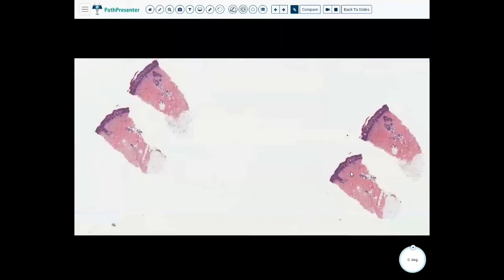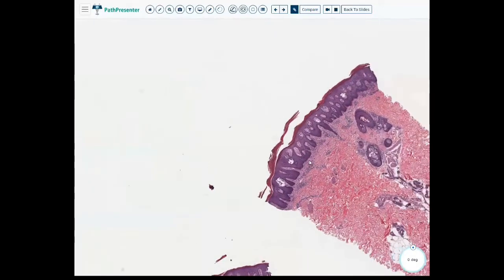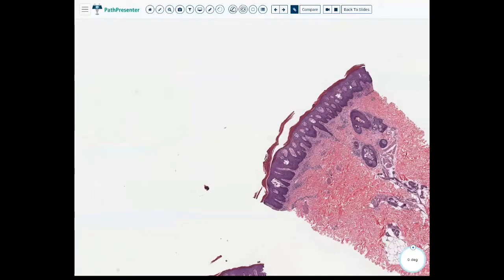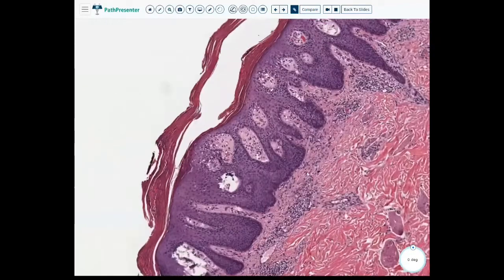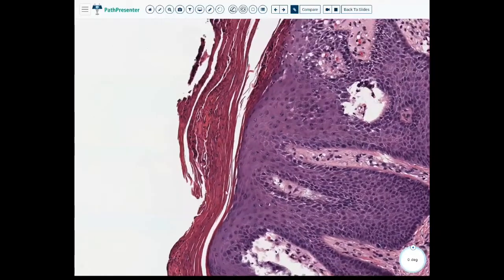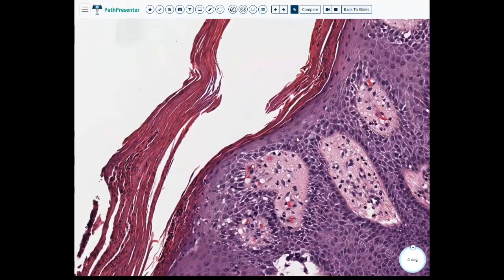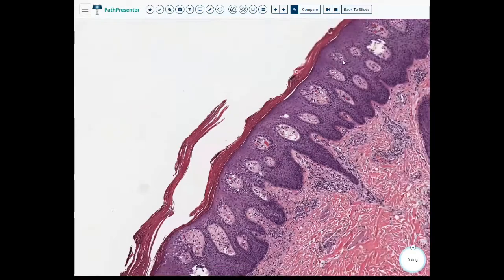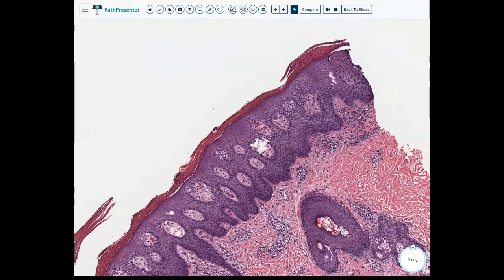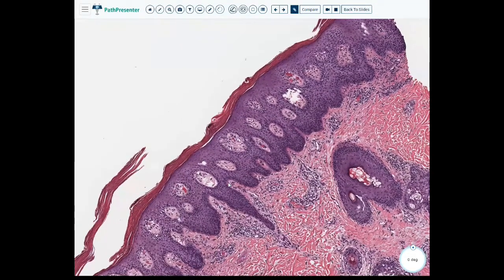Case 9, again, we see this acanthosis. These dermal papillae that are really coming up, and some sort of hyperkeratosis. Okay, and what we see is that it's actually parakeratosis. You can make out those nuclei. And this is what's called confluent parakeratosis. So it goes all the way across, unlike our pityriasis where it was mounded. So some of you probably already know where we're going with this.